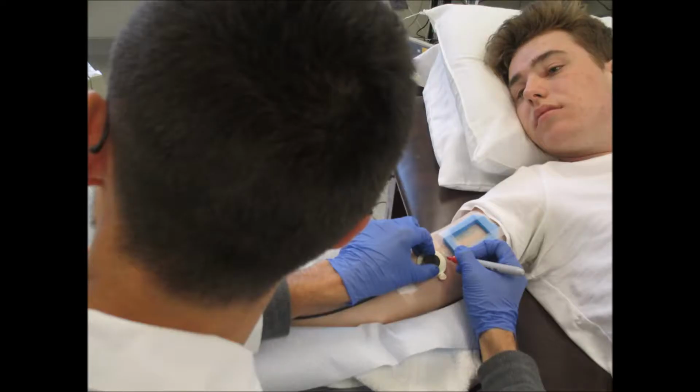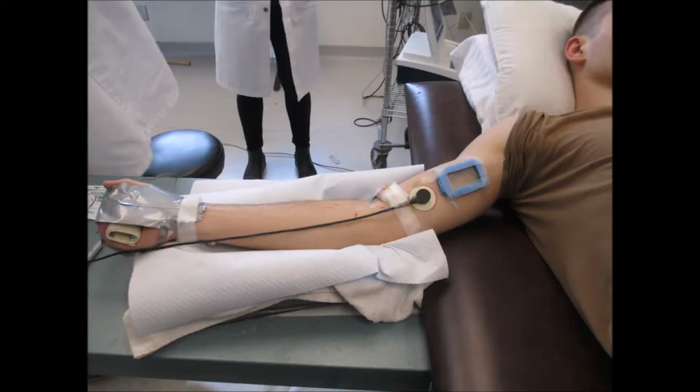Within our lab, forearm mean blood velocity is measured using a 4 MHz pulsed Doppler flat probe. This is securely fixed to the skin over the brachial artery above the antecubital fossa of the exercising limb. To obtain the measurement with minimal error, probe inclination angle relative to the skin should be around 45 degrees, with the brachial artery approximately parallel to the skin surface.